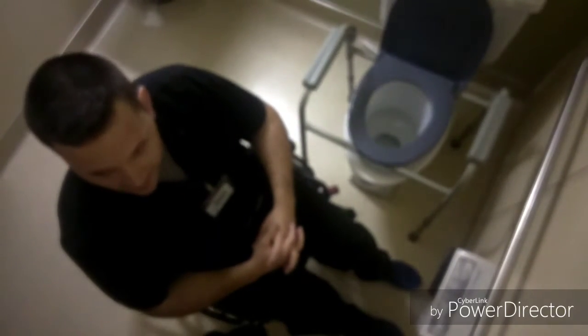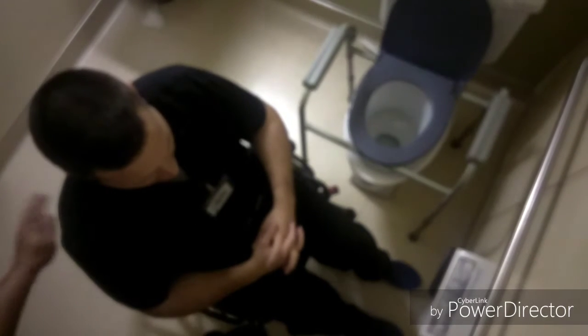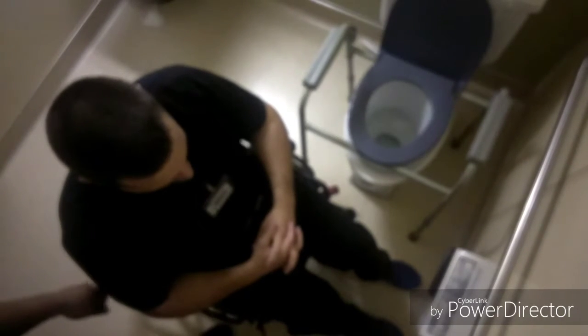Okay, Fred, I'm going to teach you, or actually what I'm doing is I'm making a video for your caregiver to have so that she can know how to transfer you to the toilet, okay, from the wheelchair. So what I'd like to get across is having a gait belt on, the safety of having the brakes on, and how you're just going to transfer. So you're just a little bit weak.